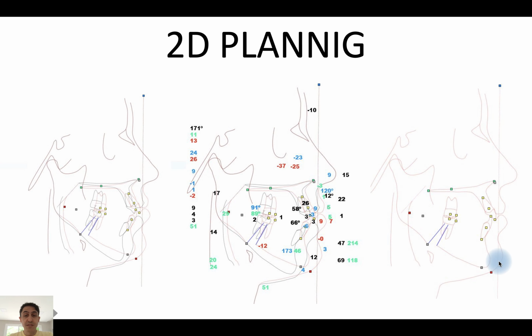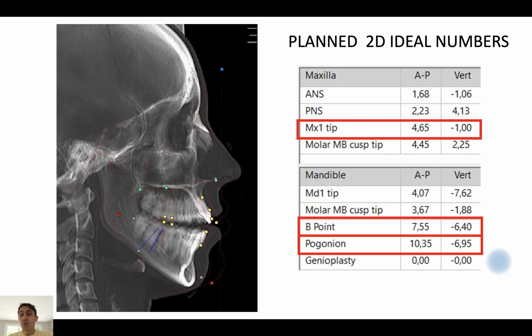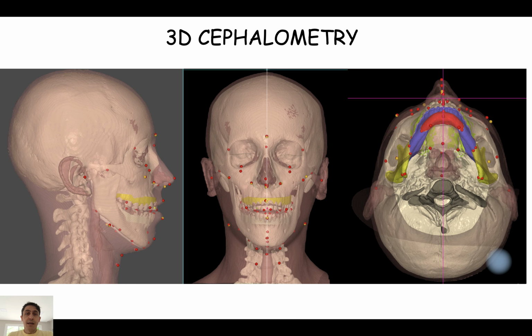You proceed with the sagittal analysis and trace a sagittal advancement, and you can get as much precision as possible in this sagittal movement of the jaws. And you can have here the numbers that I got after this projection.